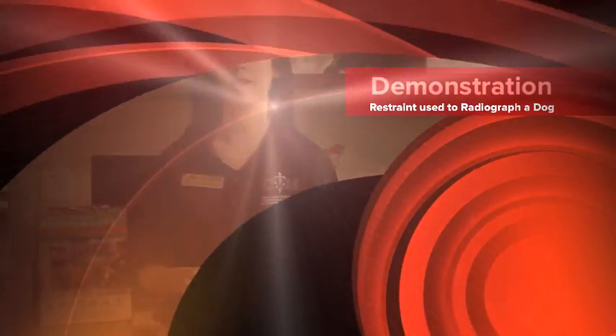So today, one of our veterinarian technicians here at the vet school, Holly Callas, is going to demonstrate the restraint used to radiograph a dog.